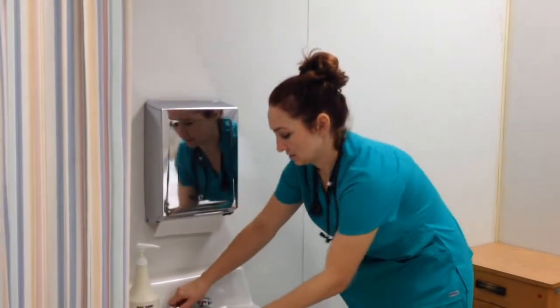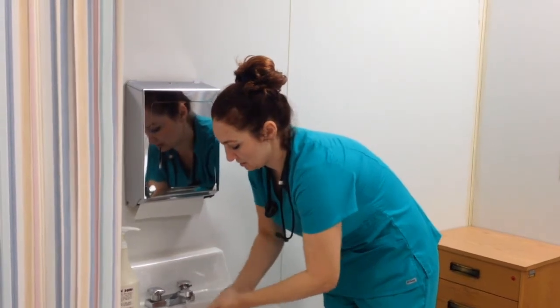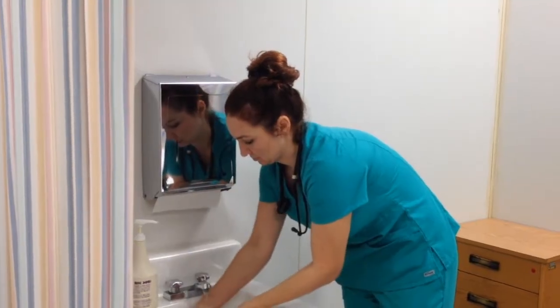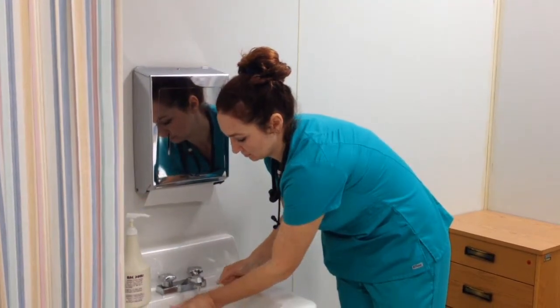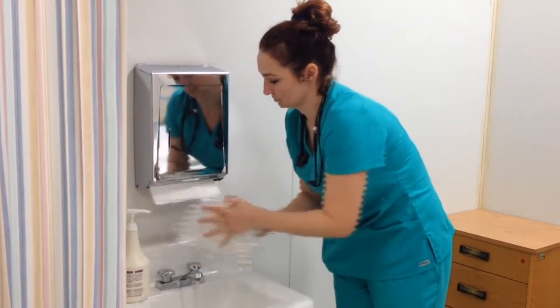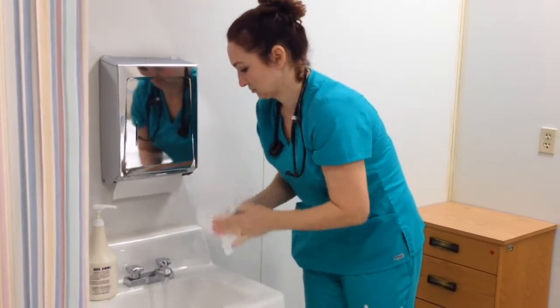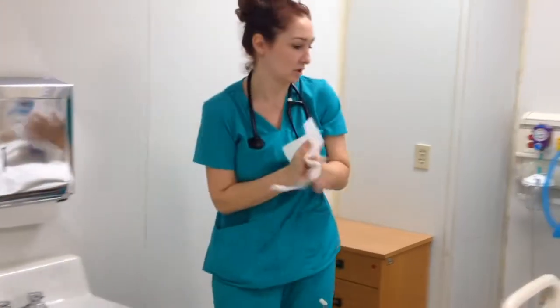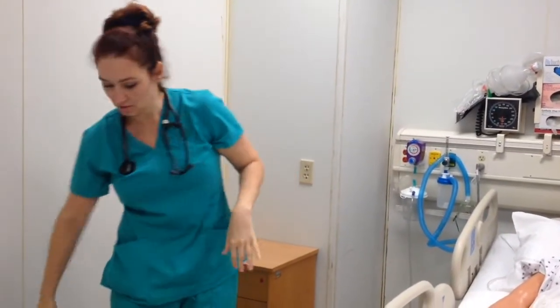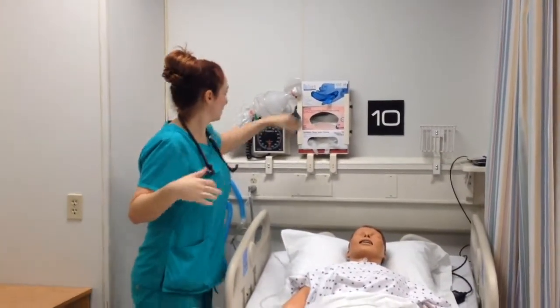Are you having any pain today? No. Just going to wash my hands and make sure they're good and dry so I can get my gloves on. I'm just going to check your chest tube placement and check your lung sounds to make sure that everything is okay.